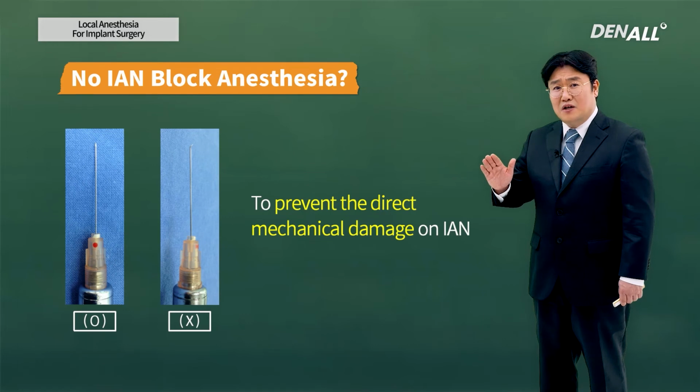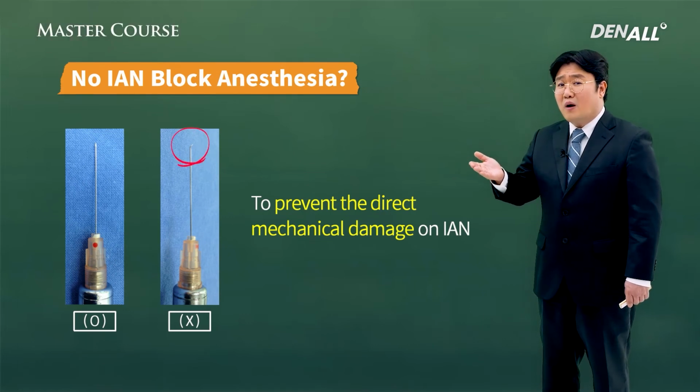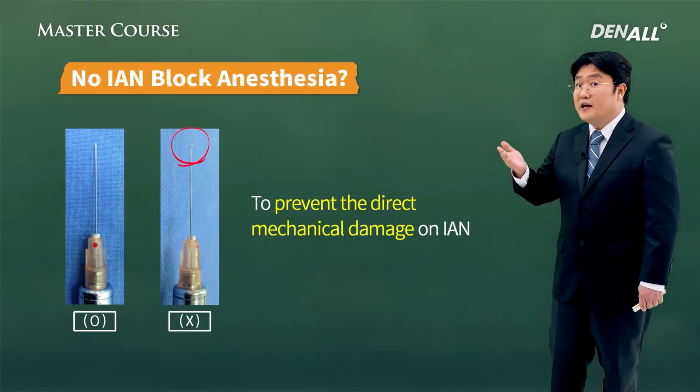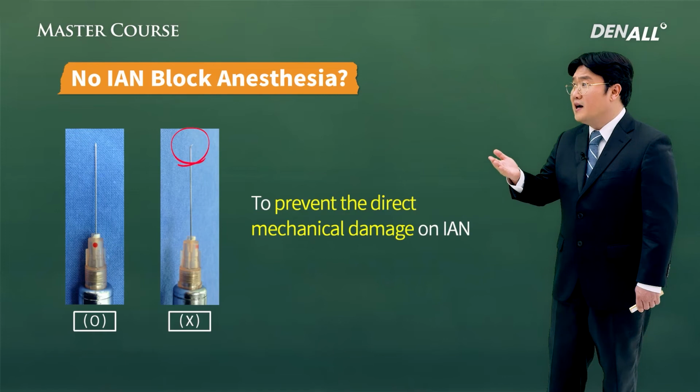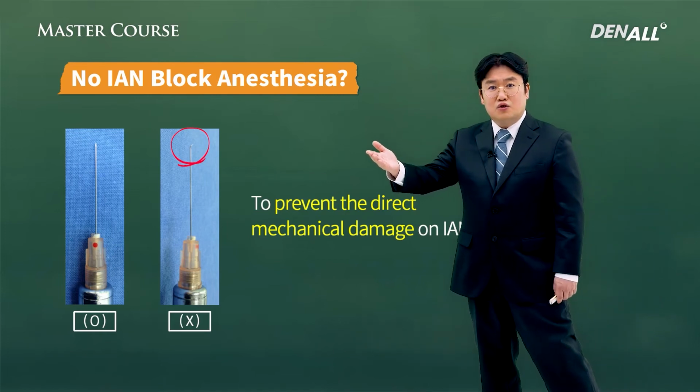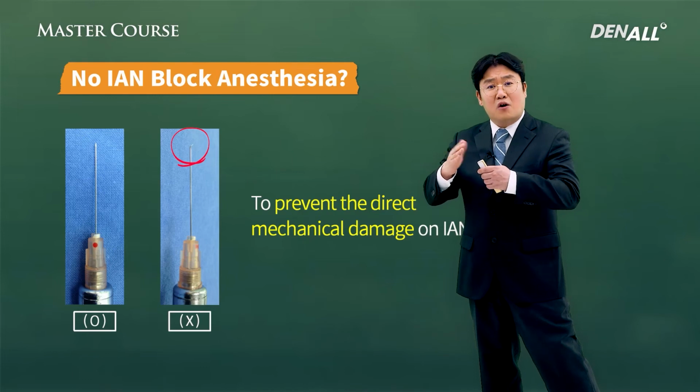However, what about this? Before conducting block anesthesia, infiltration or supraperiosteal infiltration was done, and the tip of the needle is damaged. The needle tip bevel is bent.